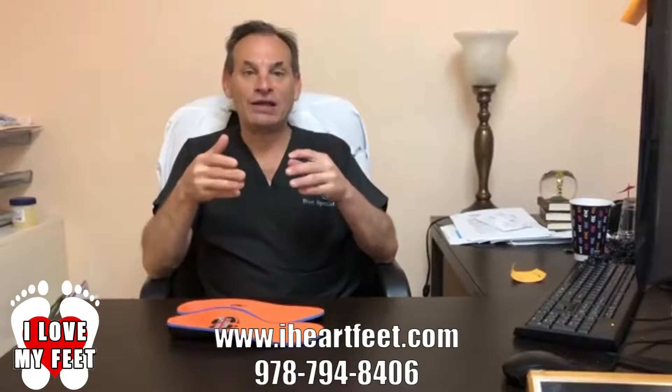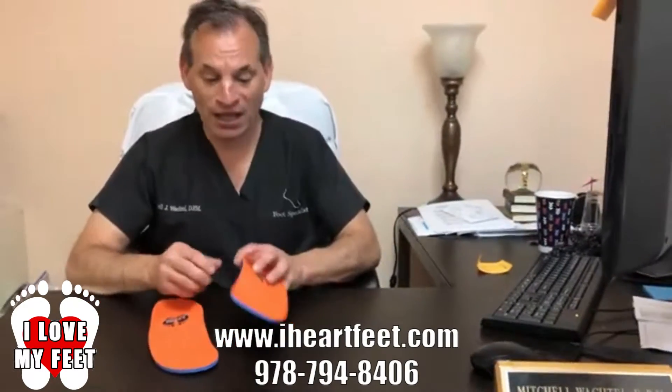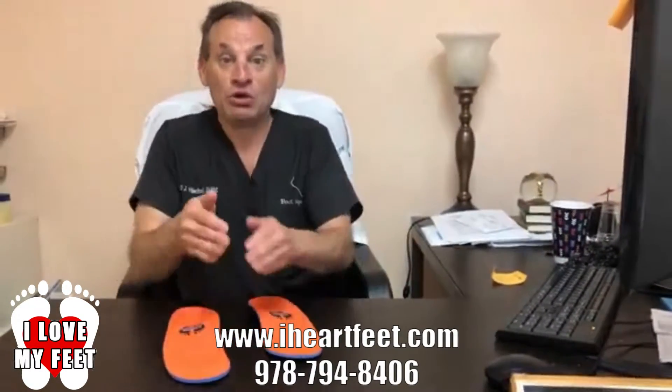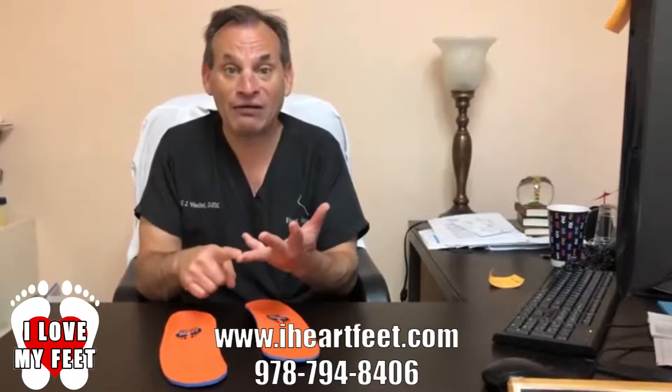When the foot lands it pronates and we break our fall. Unfortunately, when we break our fall that creates a lot of injuries. It's called pronation, and many people that are flat-footed over-pronate. These inserts are extremely sturdy and will not allow your foot to collapse, which is the biggest problem with people with knee pain, ankle issues, hip issues, and back issues. The foot collapses and the whole inner structure of the body collapses with it.